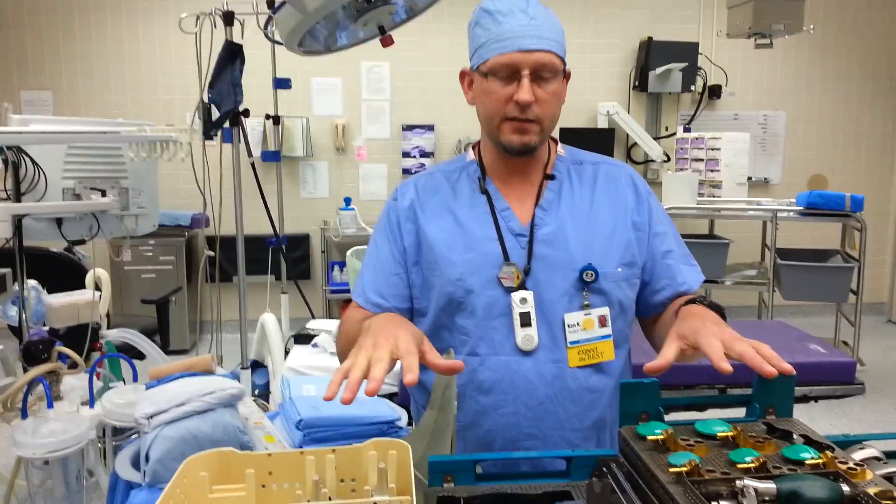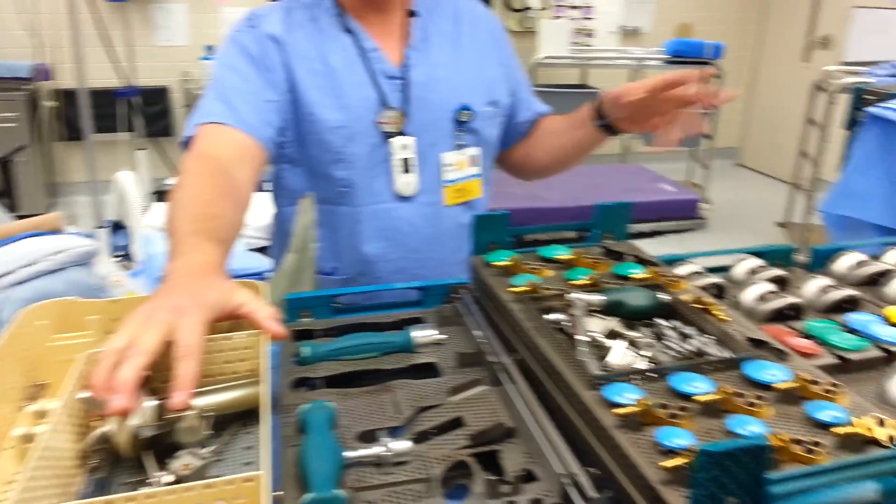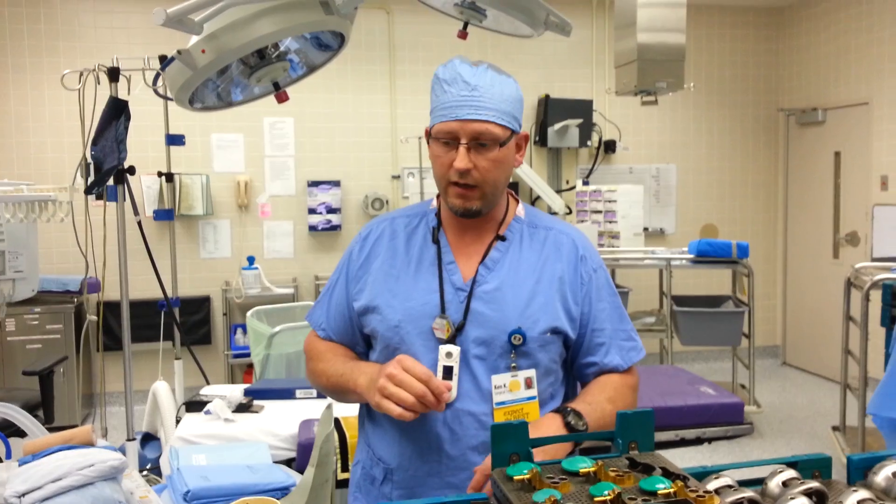It's Ken here again with triathlon knee setup. We're going to go over the navigation instruments and setting up the cutting blocks. This goes along with the video I did earlier about the total knee setup.